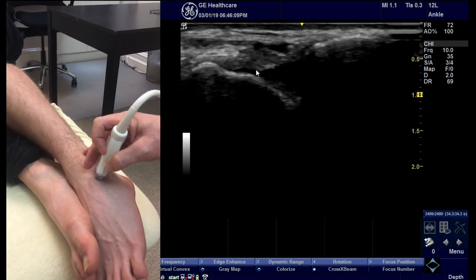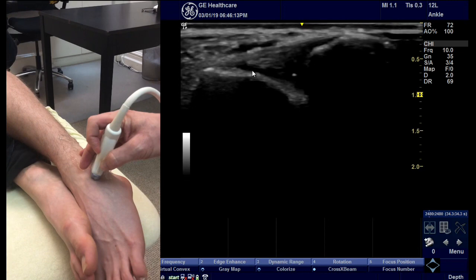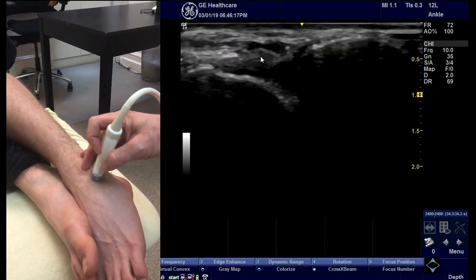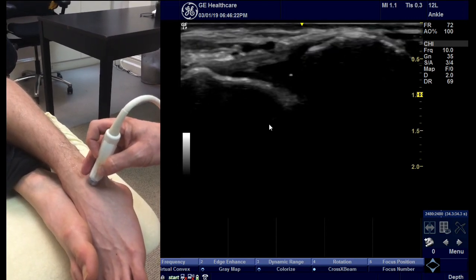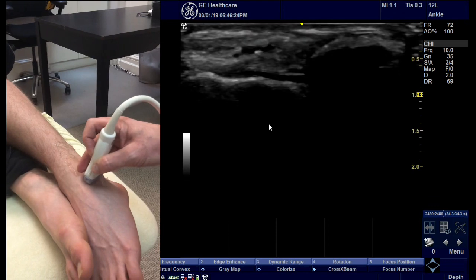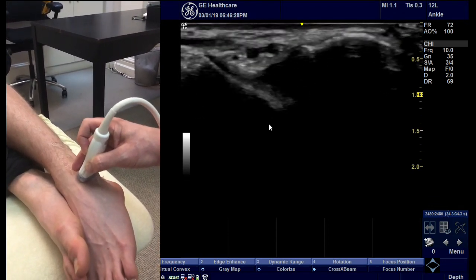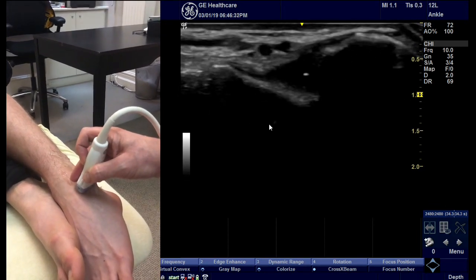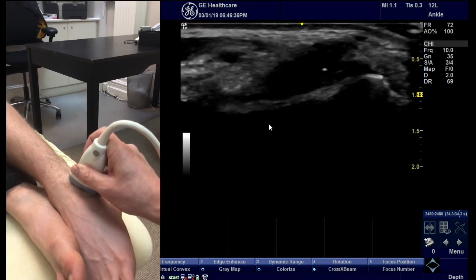That's coming into view there. Once you find that angle, you then just move down in that plane, backwards and forwards, and this is the ligament here. You can see that I'm oblique because the ligament appears to travel across the screen. So I change my angle slightly until the ligament comes in and out of view altogether. That's the long axis, and I'm passing through the whole of the main part of the AITFL.